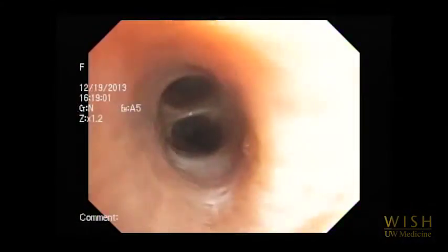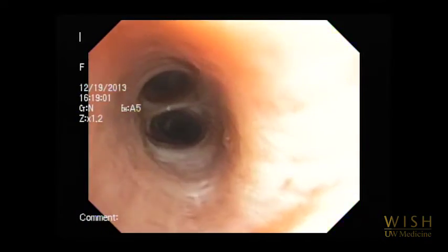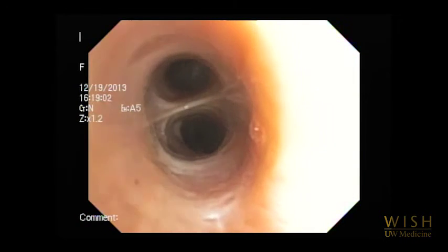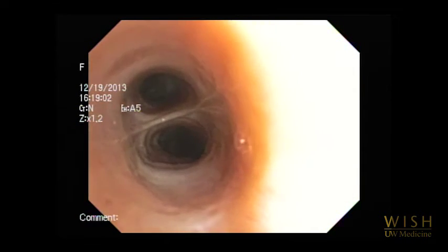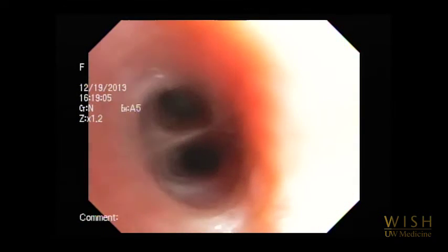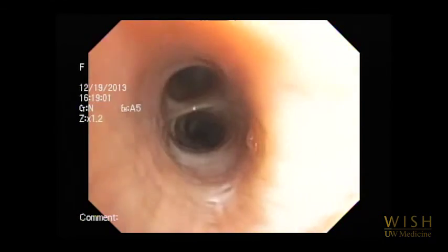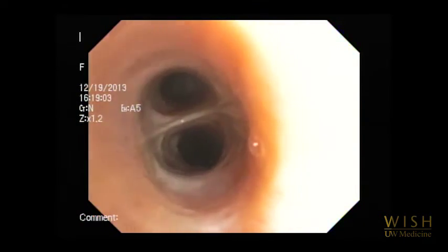Once wedged in the peripheral airway, it is often useful to apply brief, gentle suction to determine if the airway collapses with suctioning. If collapse of the airway lingers after the suction button is released, the scope may be wedged in too deeply and need to be retracted slightly. Also, one should use low-pressure wall suction to avoid complete, prolonged wall collapse during suctioning, as this will also decrease the yield of lavage fluid collected.